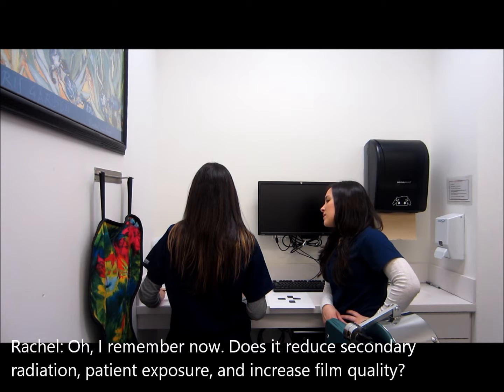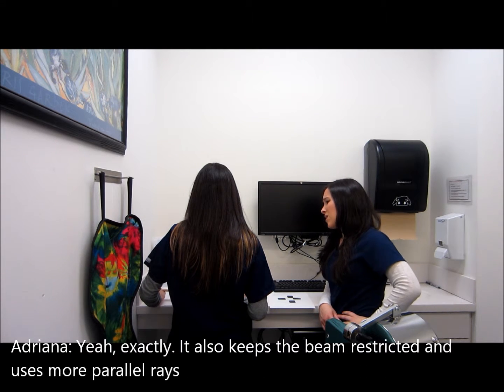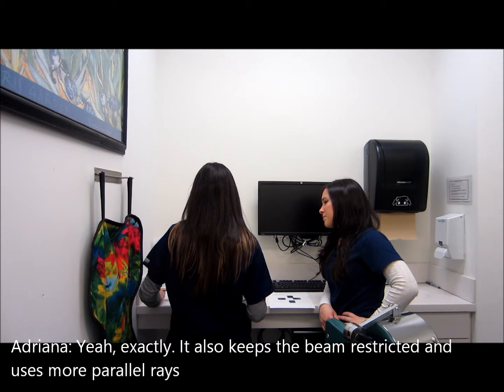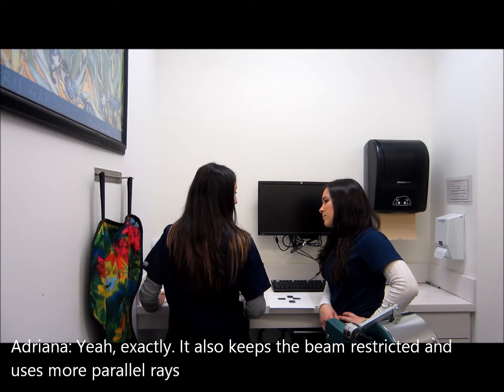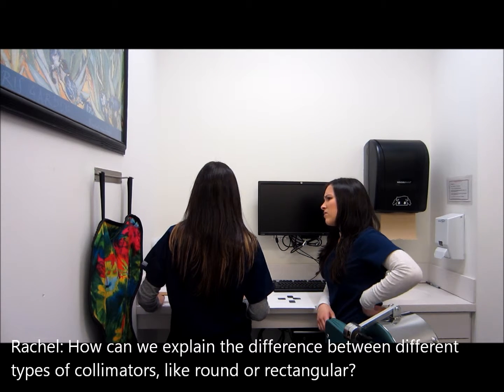I remember now. Does it reduce secondary radiation and patient exposure and increase film quality? Yeah, exactly. It also keeps the beam restricted and uses more parallel rays. How can we explain the difference between the different kinds of collimators, like a round and a rectangular?